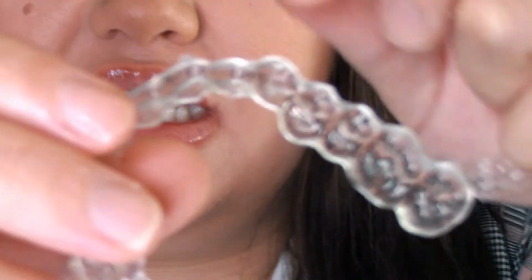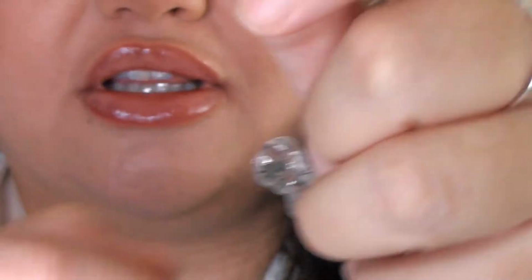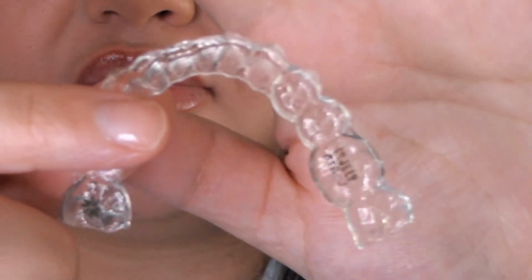I'm going to keep my old trays. They're right here. I'll keep them in the little bag that it comes with. And now I have my next set. This is my third out of 14. It doesn't really matter, but I'll go ahead and show you what they look like. Everything's clean, so I'll go ahead and pop them in.